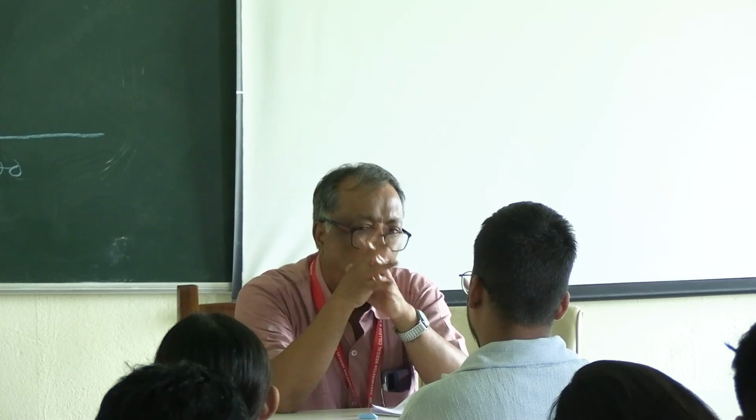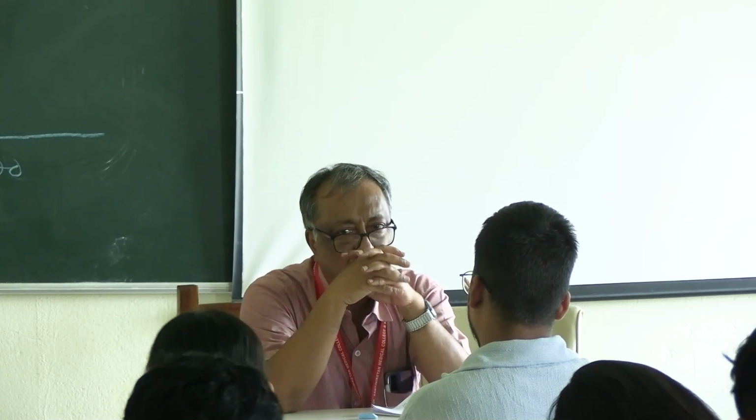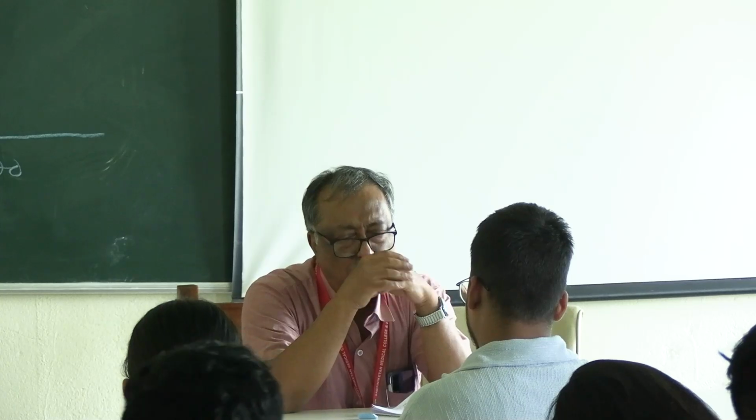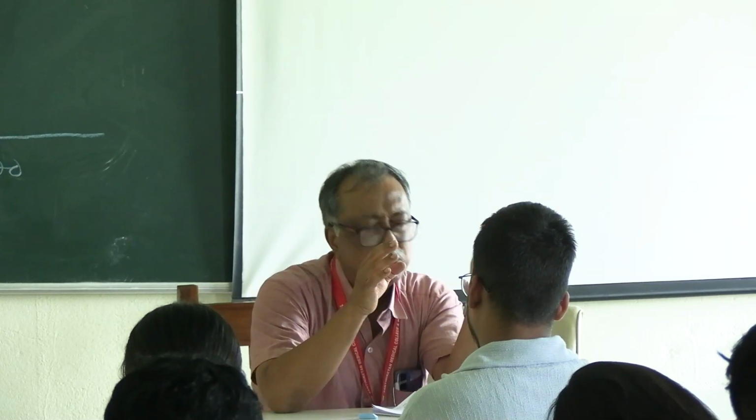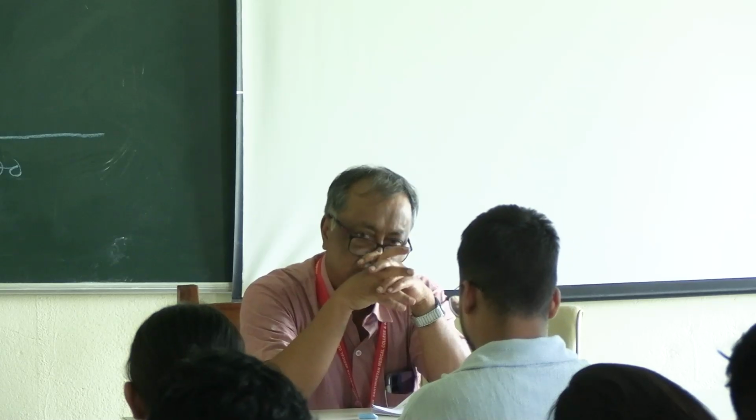Stapedial reflex is a very important and very difficult part for the MBBS, but it is always done with impedance audiometry. We do the stapedial reflex for diagnosis.